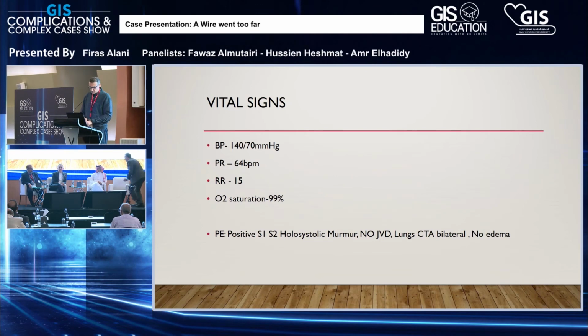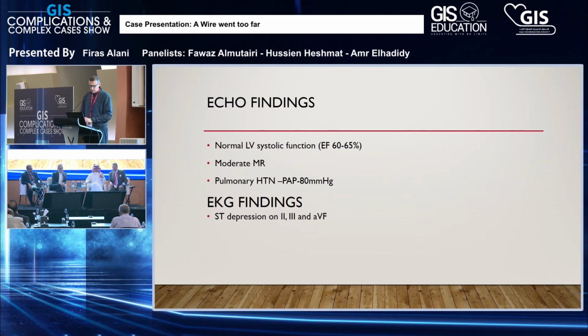These are her vital signs. Examination was unremarkable, though she had a murmur of mitral regurgitation. I'm going to go quickly through the case. We did an echo, which showed normal LV systolic function. There was moderate MR, and she had severe pulmonary hypertension. The ECG showed some ST segment depression in the inferior leads.